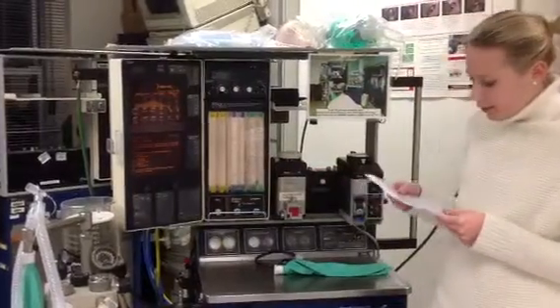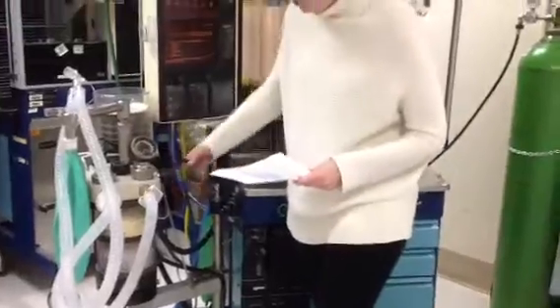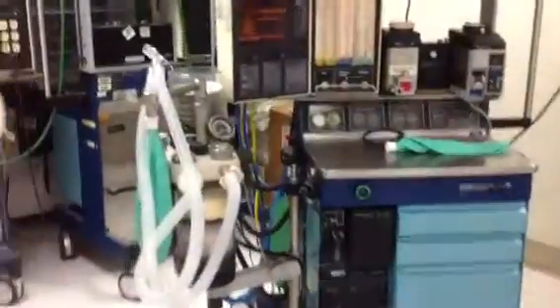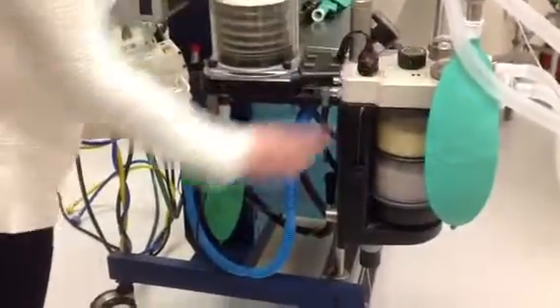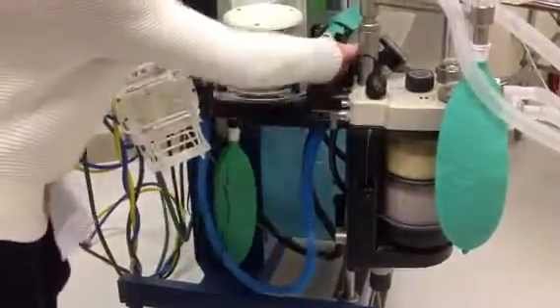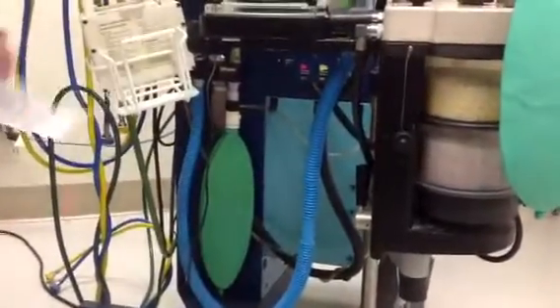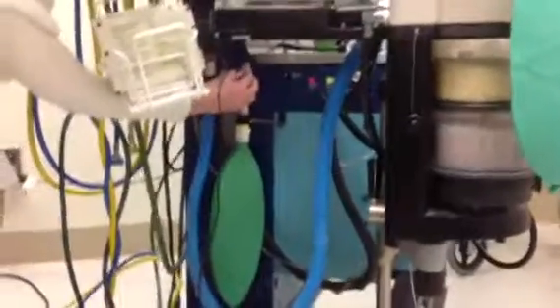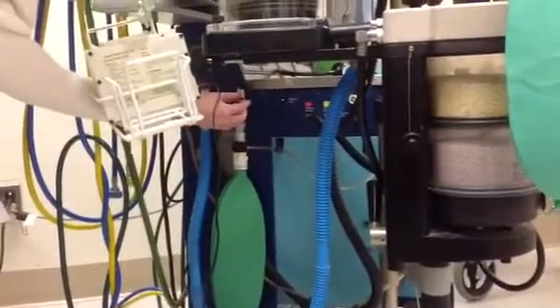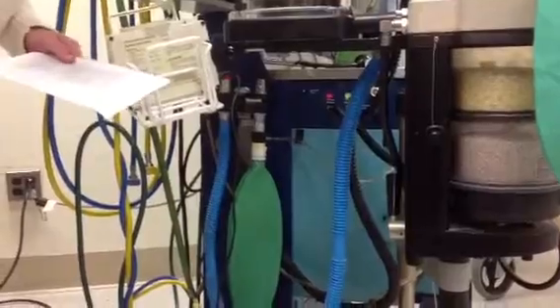So then we're going to check the scavenging system on this side. Ensure there is a proper connection between the APL valve and the ventilator relief valve. So this is the APL valve. It's hooked up over here to here, and this is the ventilator relief valve. Adjust the waste vacuum. There should be some suction device connected here that pulls out the waste.